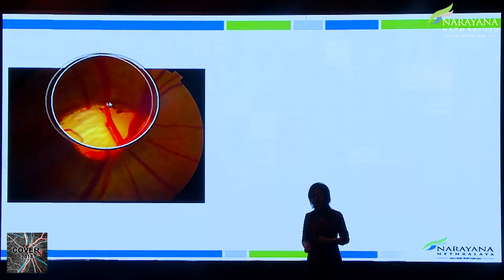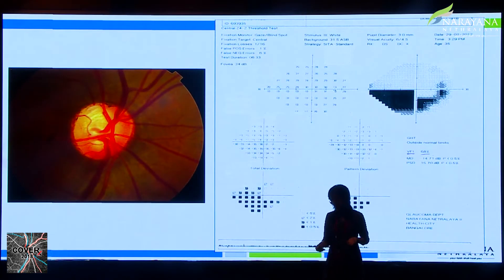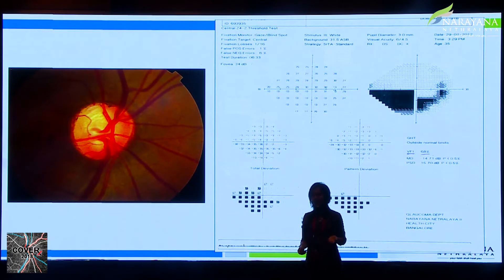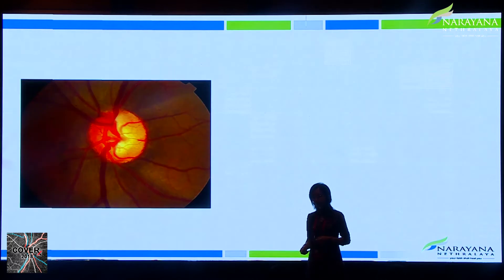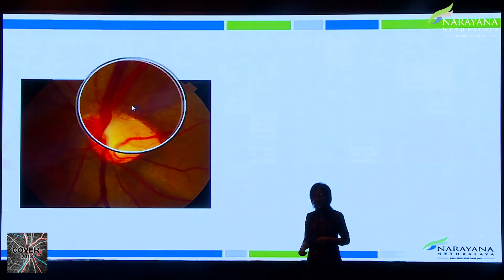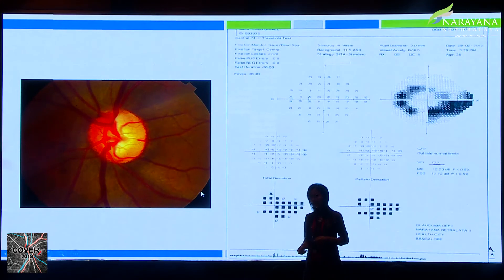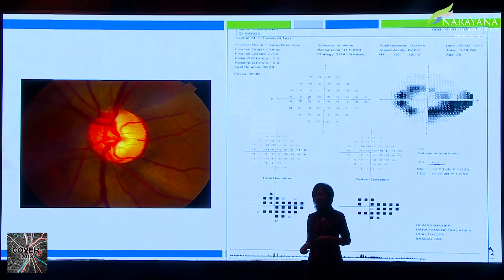A few clinical examples: one disc showing an almost absent superior rim with a notch corresponds to a classical inferior scotoma on the field — matching the clinical finding. Another disc with a superior and inferior NFL defect corresponds to an almost biarquate scotoma on the field.